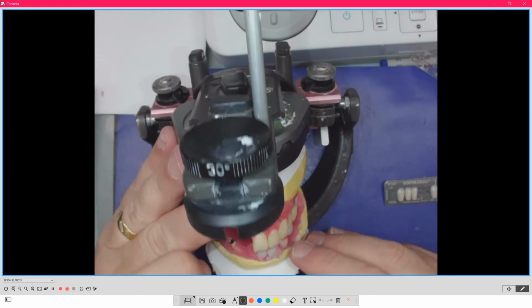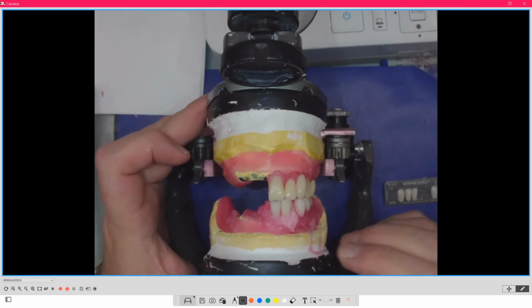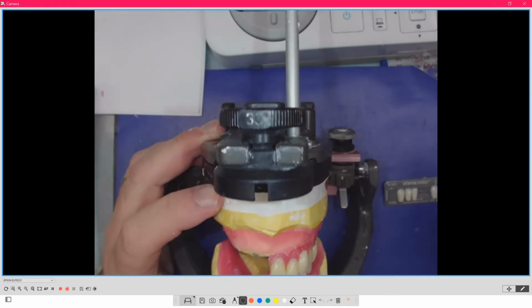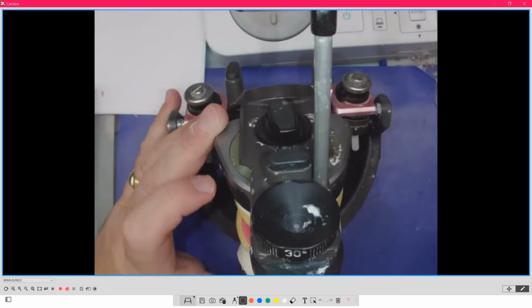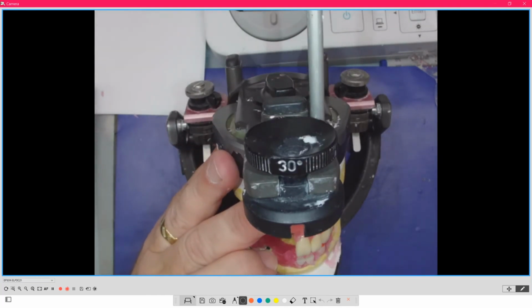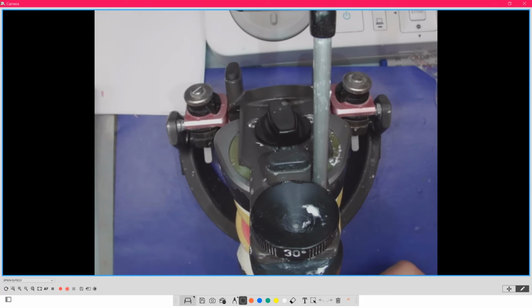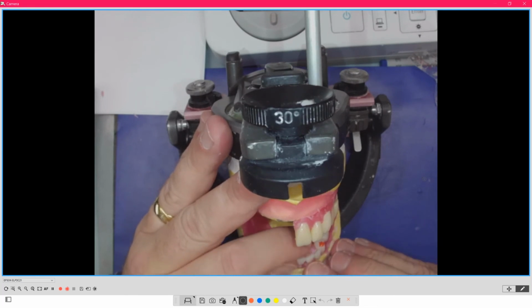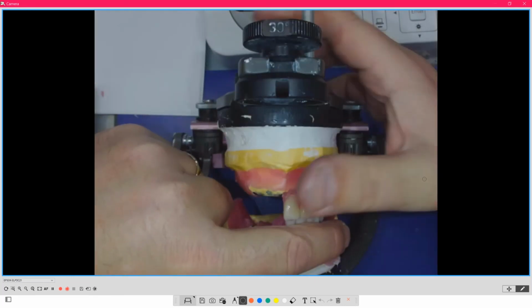The nice thing about the VITA teeth and the emergence profiles of the teeth is that you can get away with that sometimes. So I can get away with it when I have to push teeth into roles that they may not have been designed for. And that's what I wanted to show you, that I can set teeth and have them work in a design limit and a design zone that they weren't necessarily intended for originally. That doesn't matter, because what doesn't change is the freedom. What doesn't change is the chew cycle. So now stick lips on this thing.